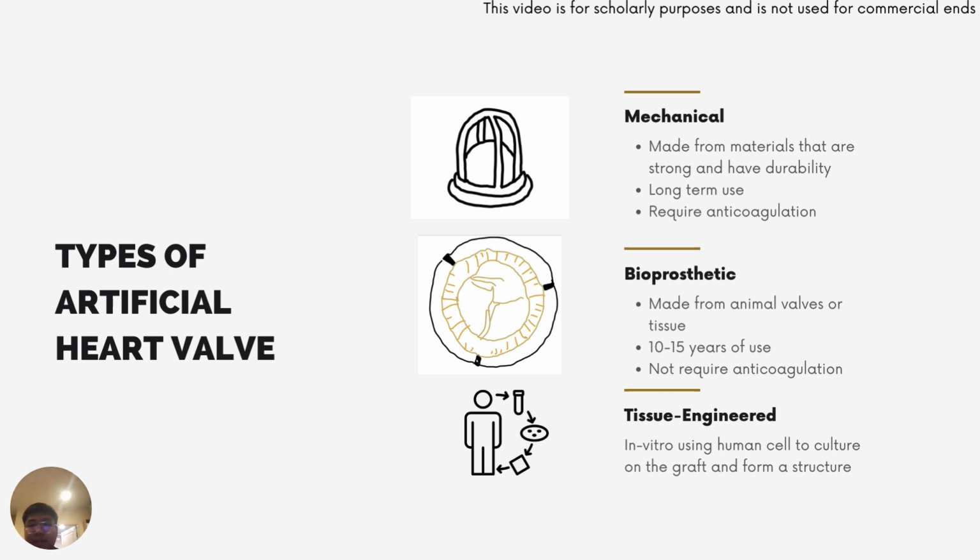Lastly, the tissue engineered valve is basically an in vitro process that puts human cells into a graft or scaffold that has the same shape as the heart valve, which can further enhance the treatment outcome.